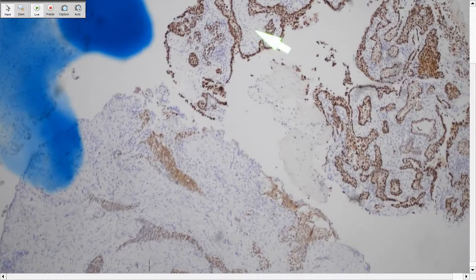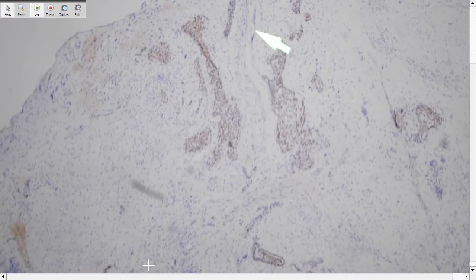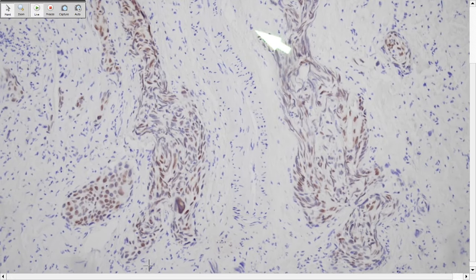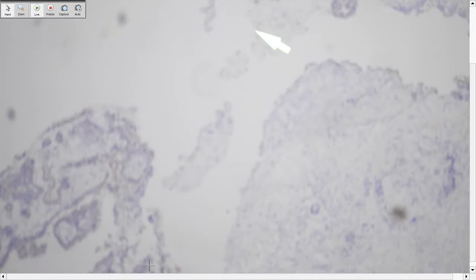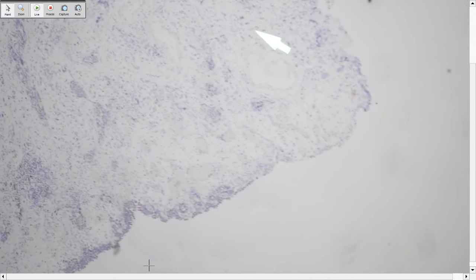Yeah, it's positive. It's past the surface and also the infiltrated components. This is urothelial. What other markers do you also want? Maybe like GATA3. The patient has endometrial. Yes, PAX8. It's good for kidney and also GYN, right? Müllerian. So it's negative. Yeah, okay, good.